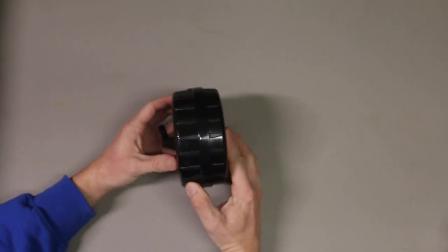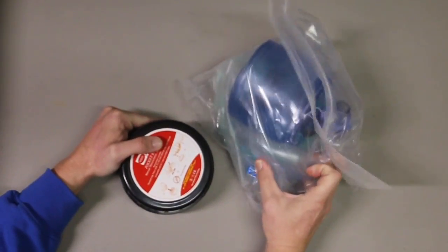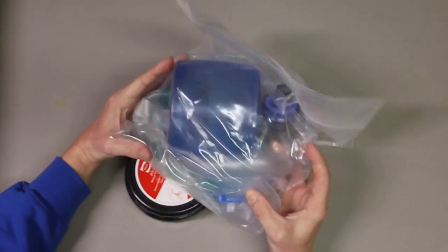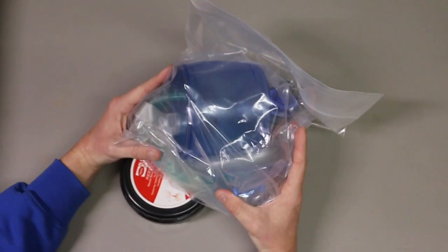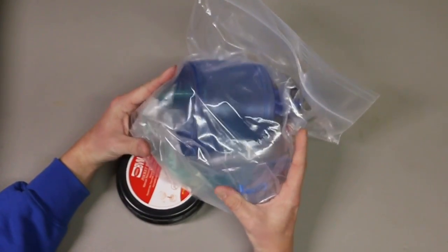So this is a Pocket BVM. It's really small, really compact as compared to, say, like this BVM here, which takes up a lot of space in your backpack, your first aid kit, whatever you're using. This does take up a lot of space.